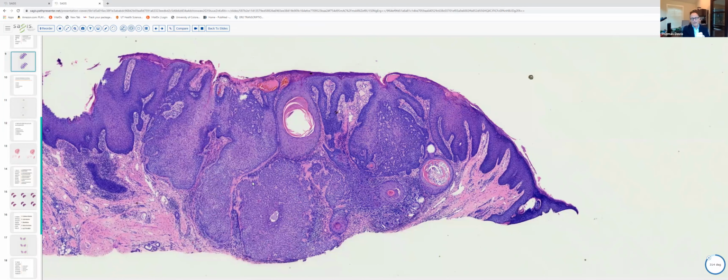One of the epithelial neoplasms that I think can mimic a trichilemmoma, and sometimes it can be hard if one has a partial biopsy, is an IFK, an inverted follicular keratosis, also a benign adnexal neoplasm derived from follicular epithelium. IFKs tend to have a little different architecture. They tend to be kind of exoendophytic. And of course, the histologic hallmark of an IFK is the squamous eddies, the whorls of partially keratinized epithelial cells. So anyway, this is a trichilemmoma.